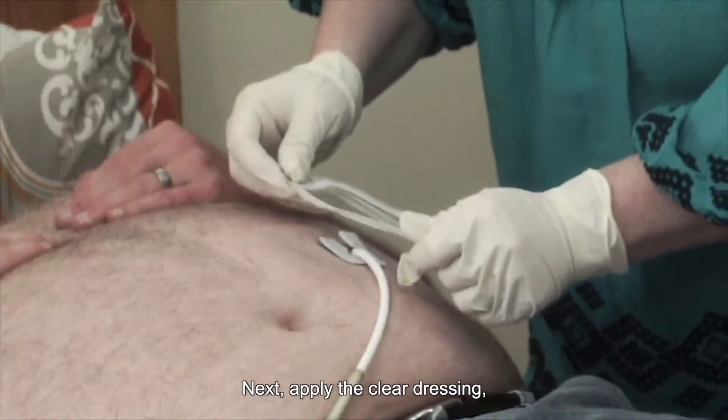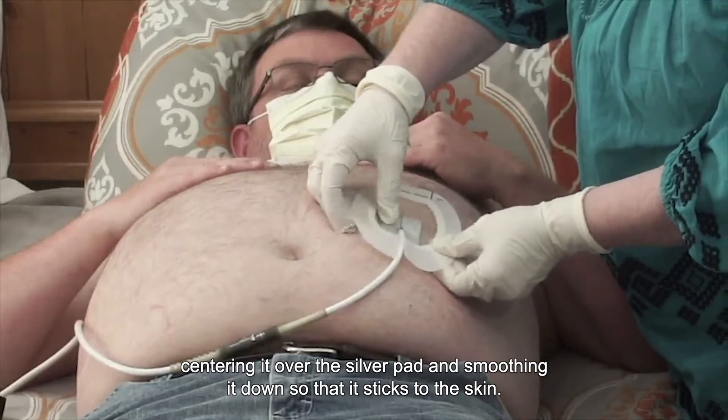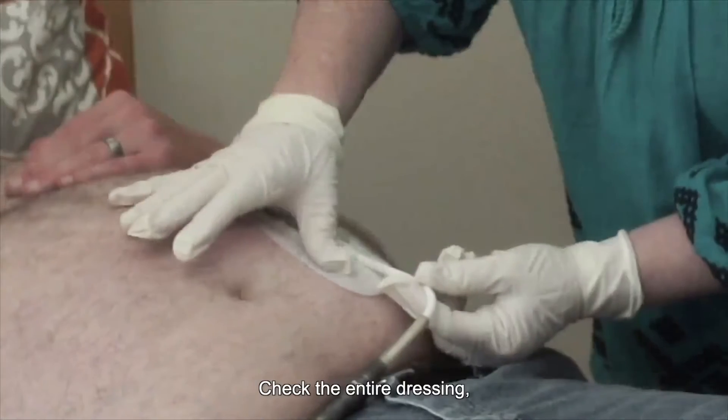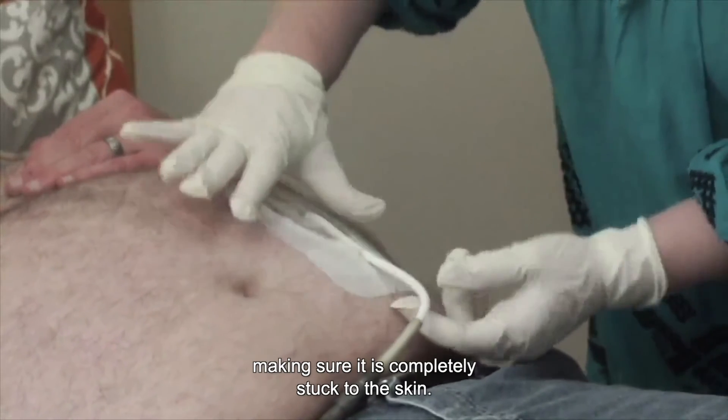Next, apply the clear dressing, centering it over the silver pad and smoothing it down so that it sticks to the skin. Check the entire dressing, making sure it is completely stuck to the skin.